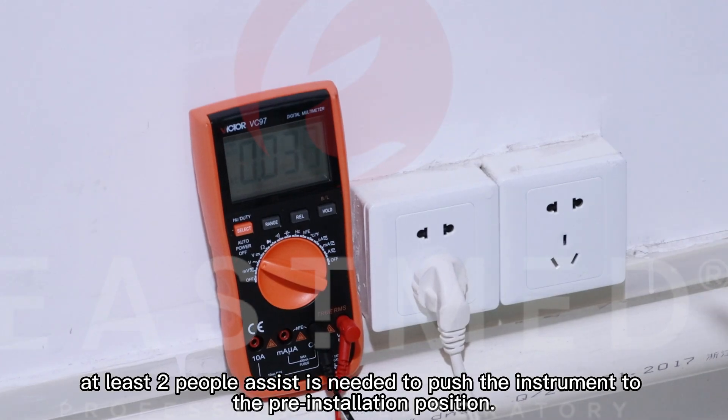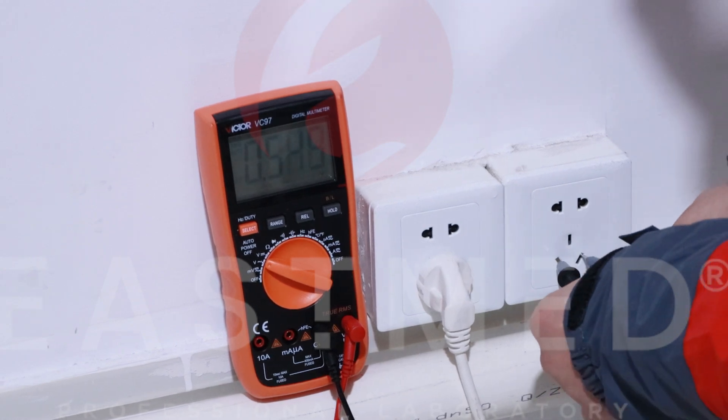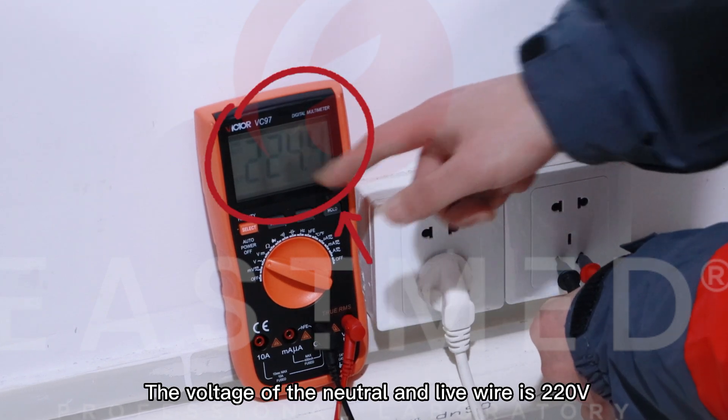Push the instrument to the pre-installation position. The voltage of the neutral and live wire is 220V.